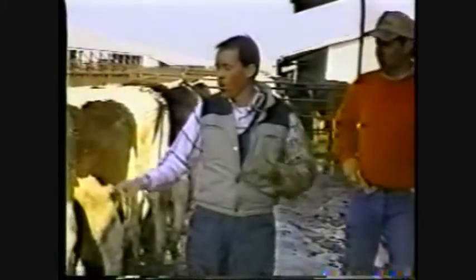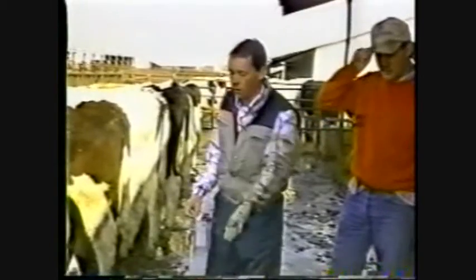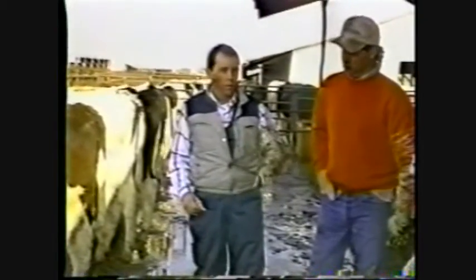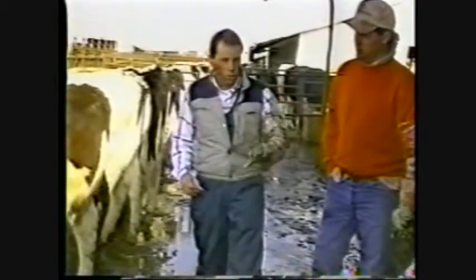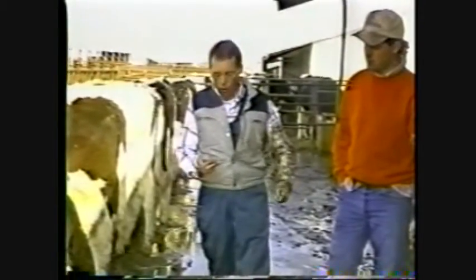You want to go into these girls again. At your cervix, you go down. You want to find the right, what's the left. Got to be sure we know what's right and what's left. And once you've determined that, feel comfortable, pick out the larger ovary and go for it. Get your feel on it.